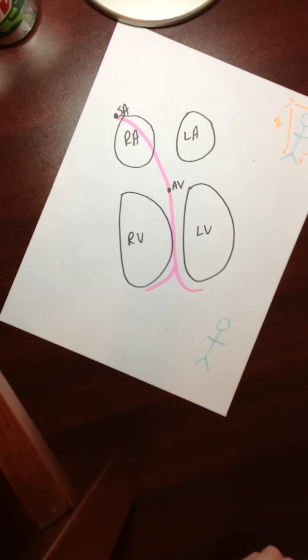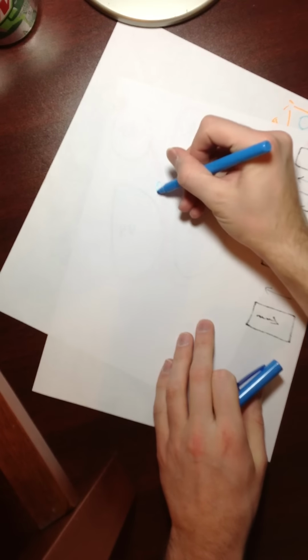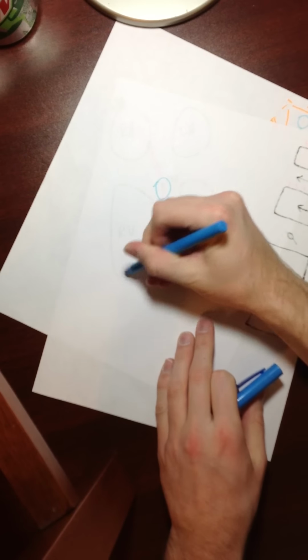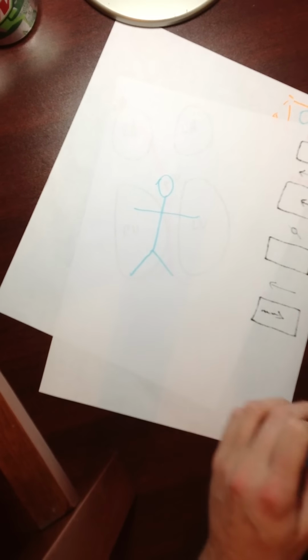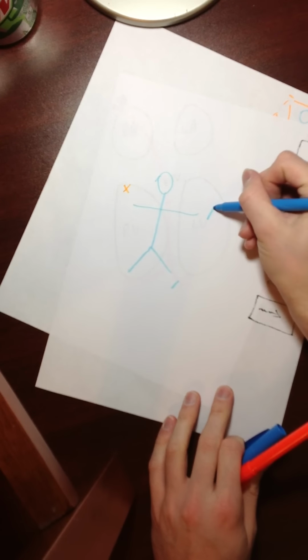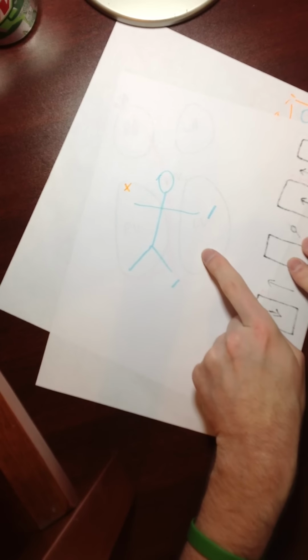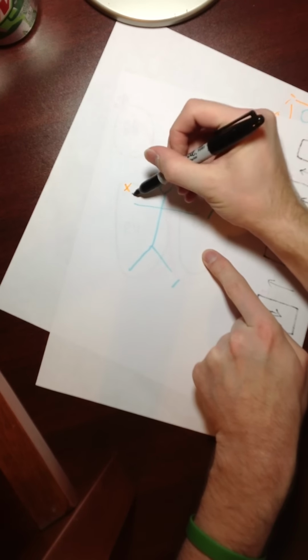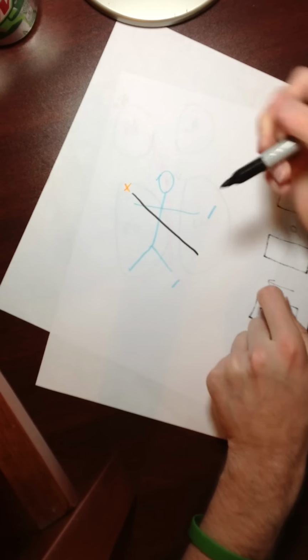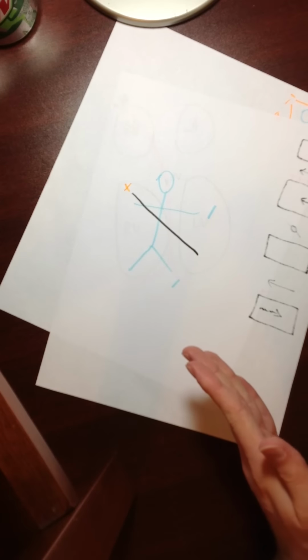If I take a bigger person here and look at AVR, I'm going to put a plus here and a negative here and here. Since there are two negatives, I take the average of them, put it here, and then take this and do this. That's why AVR is shifted towards it like that.